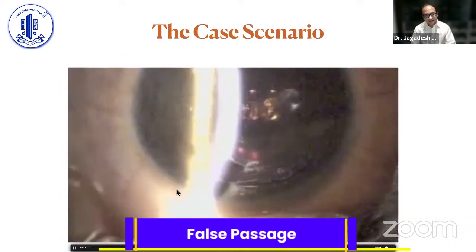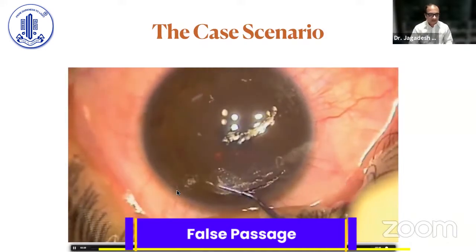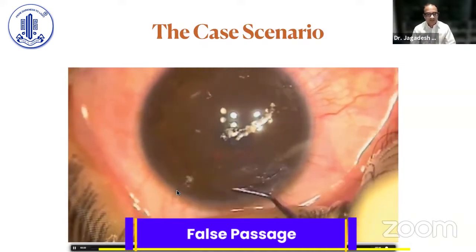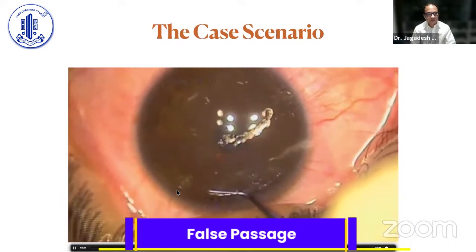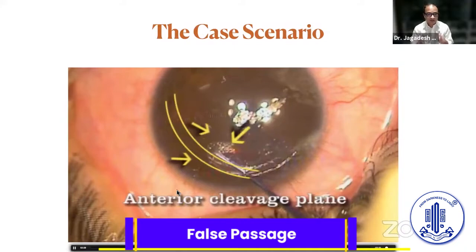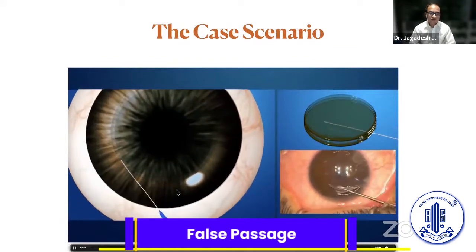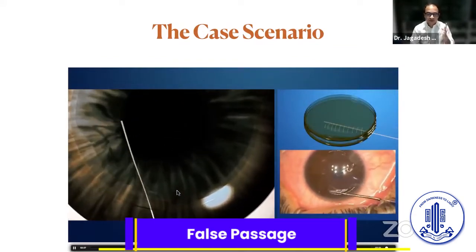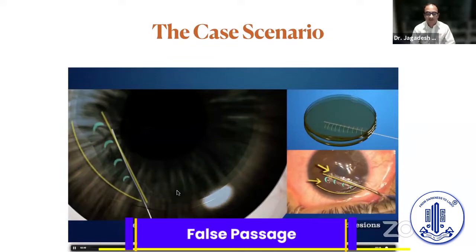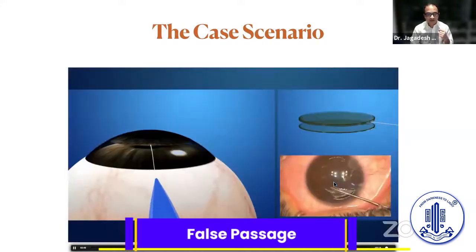And when we looked at the slit that is available, we could not make it out. Later, a second surgeon stepped into the surgery and tried to figure out what had happened. After looking at the slit lamp examination, everything, we figured out that the anterior plane was not dissected. So we started off from the periphery, pointing the dissector towards the cap and trying to delineate the edge. You can see the fold in the edge. As we go, we can see a fold.